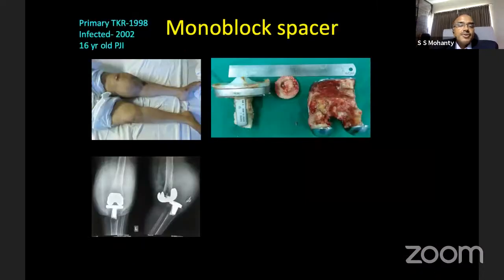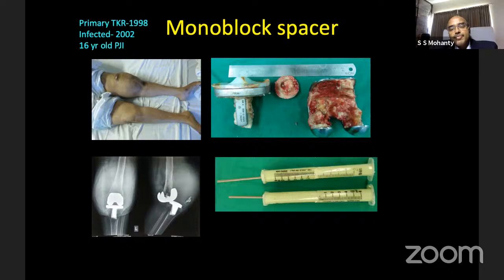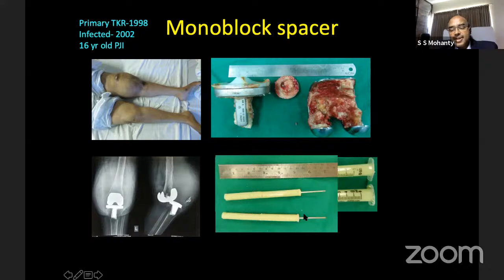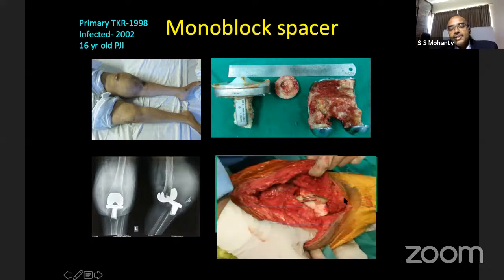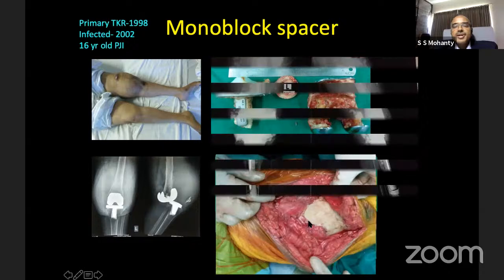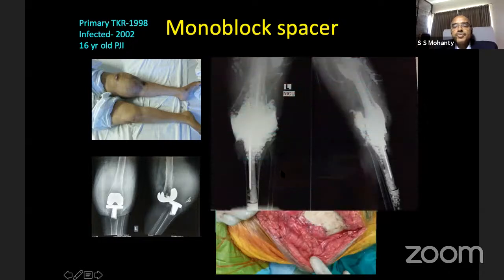This is an infected, dislocated knee, infected for more than 16 years. There is a discharging sinus there. So here, when the joint is unstable, we prefer to put a stable static spacer there. We prepare the spacer like this, taking 2 5cc syringes, joining them, putting cement dowels along with K-wires inside. Then we put one of the dowels inside the femoral canal, one in the tibial canal, and then we pack the cement in the spacer, putting a static spacer, and that is the post-operative X-ray.